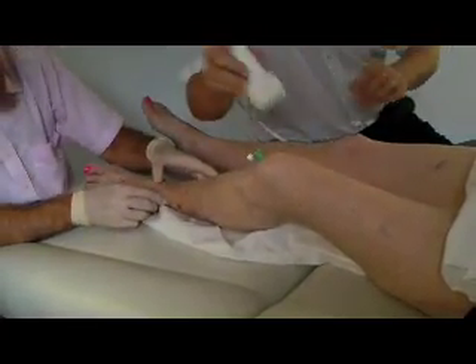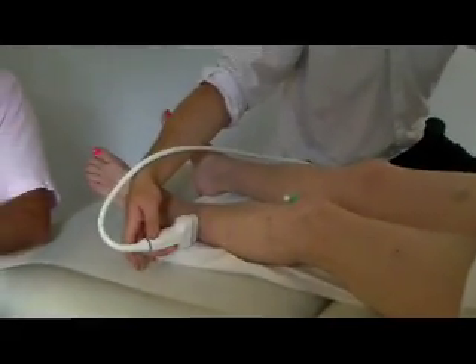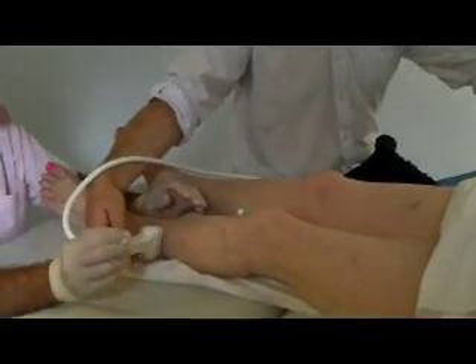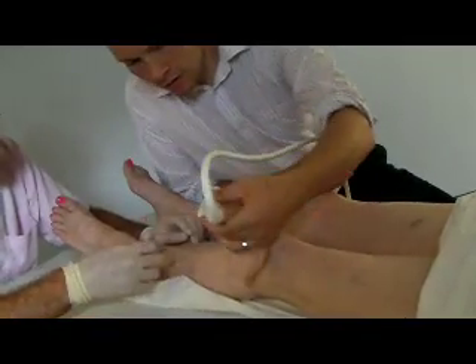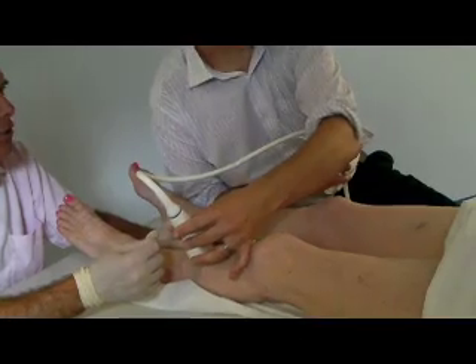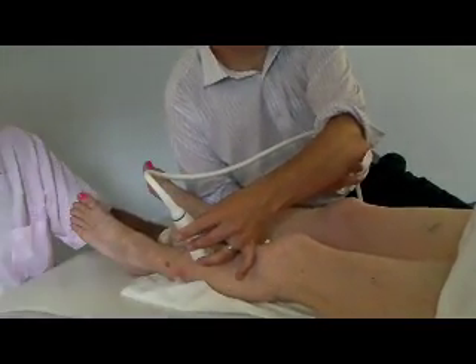The Venflon is then secured into place with some tape. For most patients with varicose veins they need to have the main vein in the thigh treated — the great saphenous vein — but also the veins that are being fed by the great saphenous or small saphenous vein. These veins are the varicosities and they can be treated in a similar way.